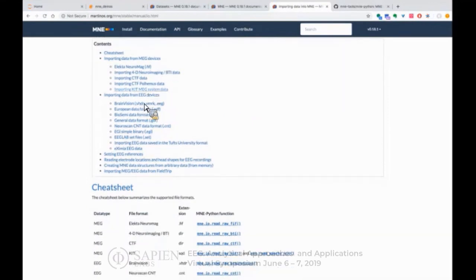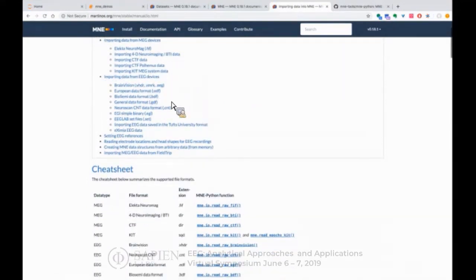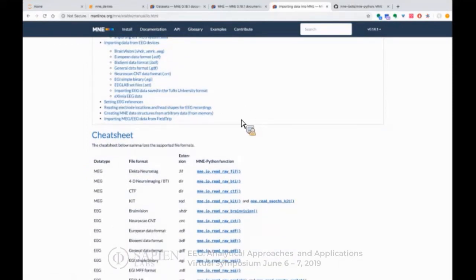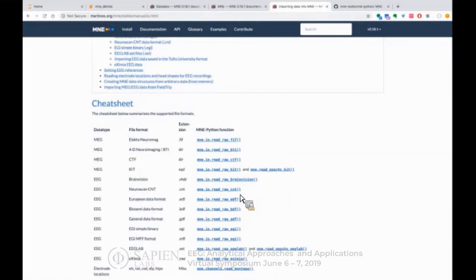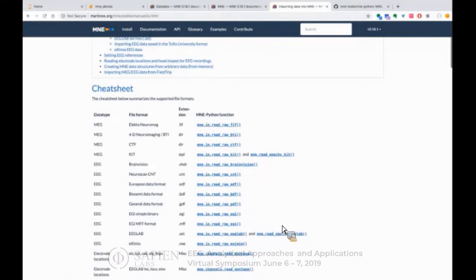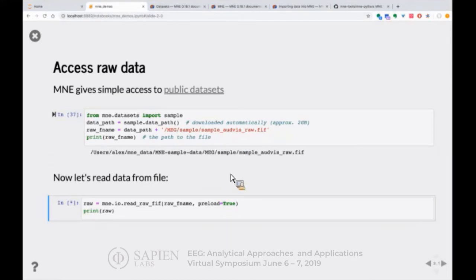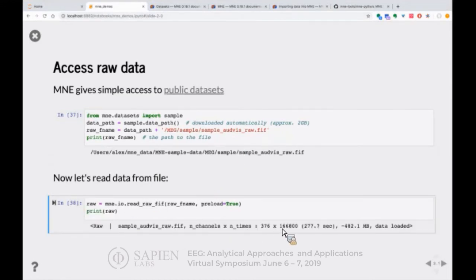If I execute this line, if I don't have the data I will download it. For me, since I already have it, you see it's going to take a FIF file. This is what we have for the sample data, but then you can read a number of other file formats. If you have different input types of data, EEG would be BrainVision, EDF, BioSemi, GDF, Neuroscan, CNT, EGI, EEGLAB, and all these things. We have a bunch of reading functions for these different EEG and MEG formats.